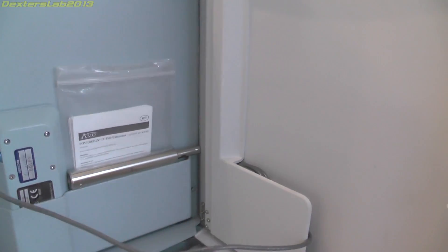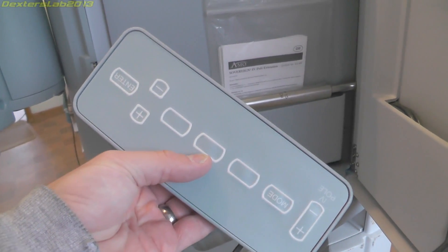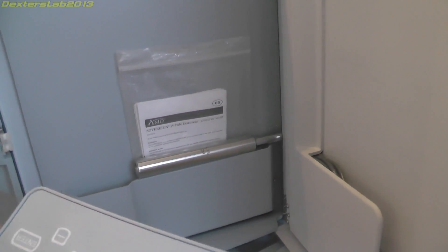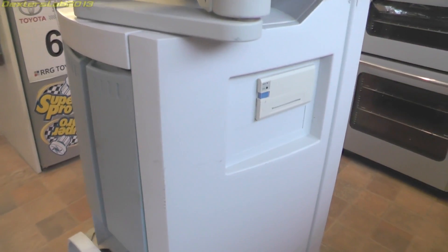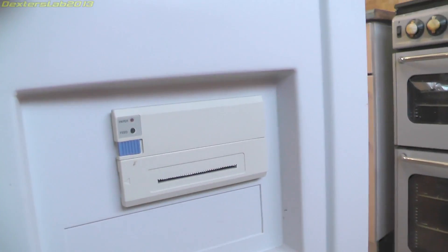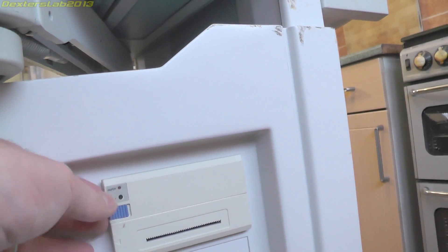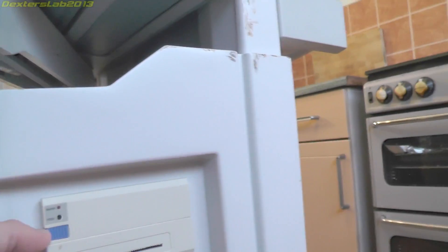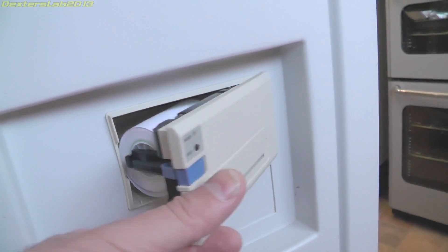On this side we just have a storage compartment with some little bits of documentation. We have a user control pad which just plugs into the front and allows you to remotely operate it. Down on the base we have a little printer mechanism in there.